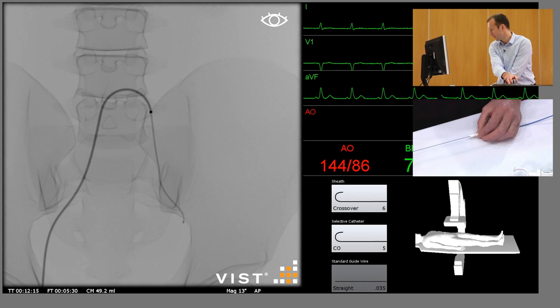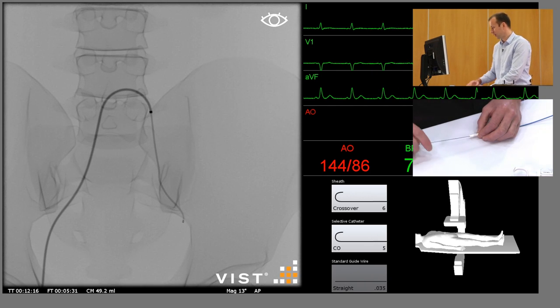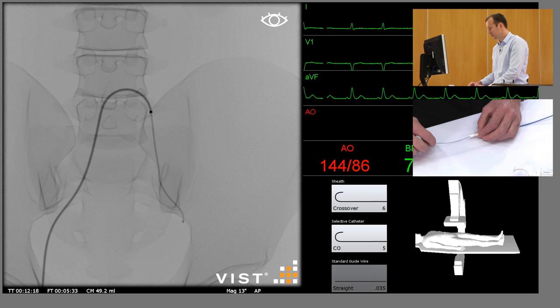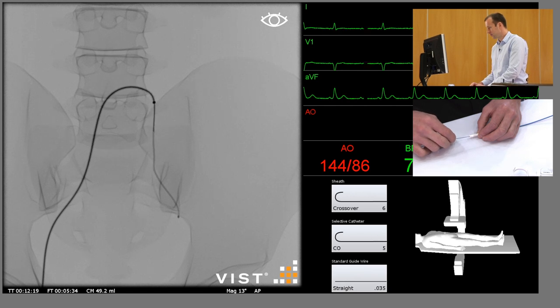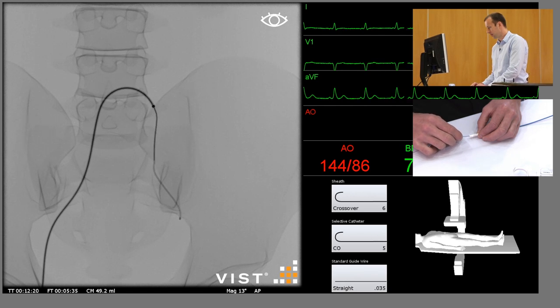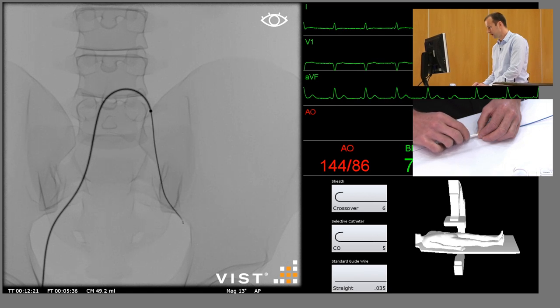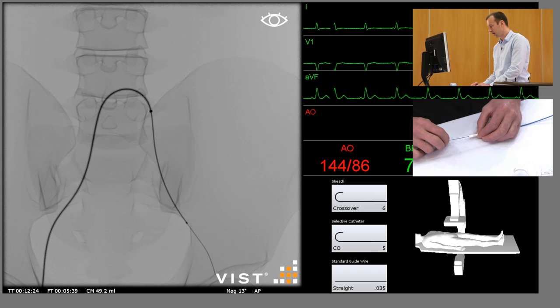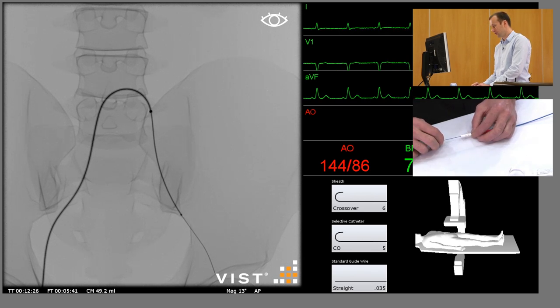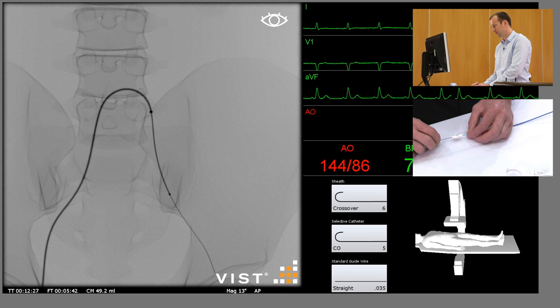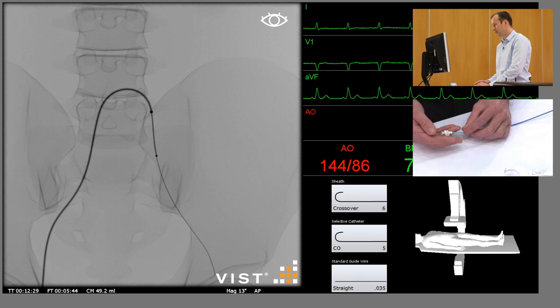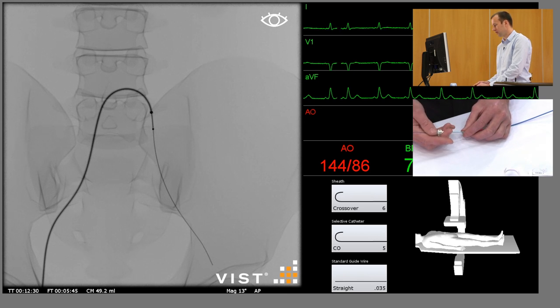Fade that image out altogether, advance the guide wire carefully, and place the distal end of the guide wire just in view. And remove the catheter.